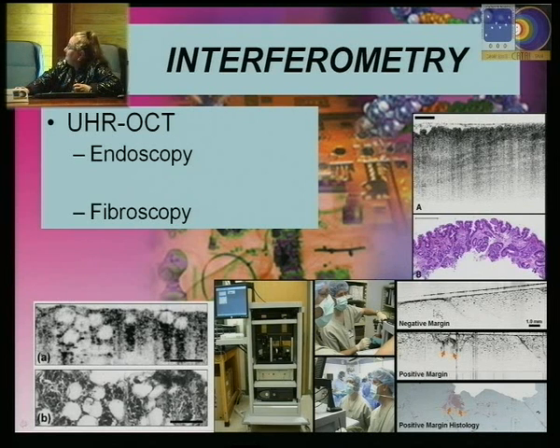For example, in here, you can see if the area of breast you are cutting in a breast surgery is free or not of tumor. In here it is free of tumor, therefore there is no problem, you can cut. And in here, the area has a tumor, therefore you cannot cut. And this is the histological image from the area you are cutting. And therefore you have to go further on in order to cut.